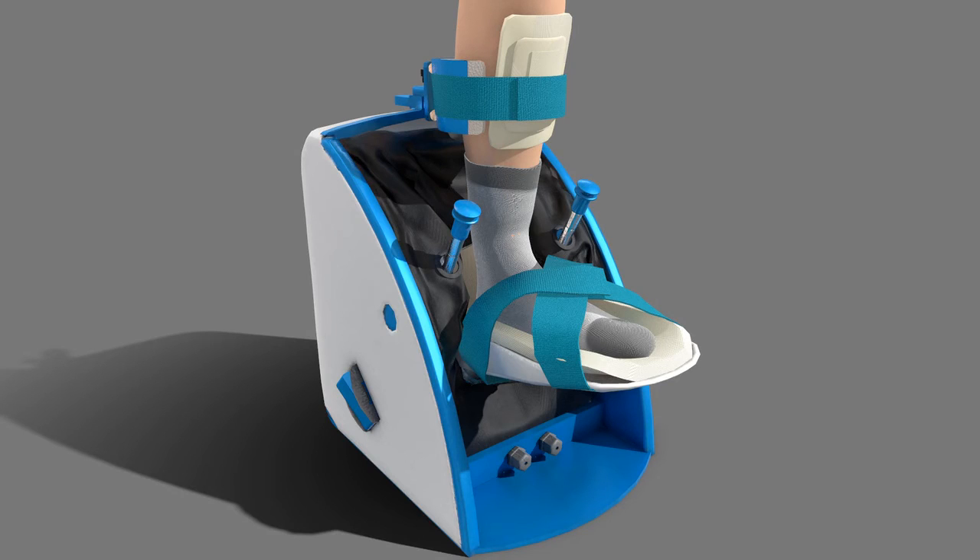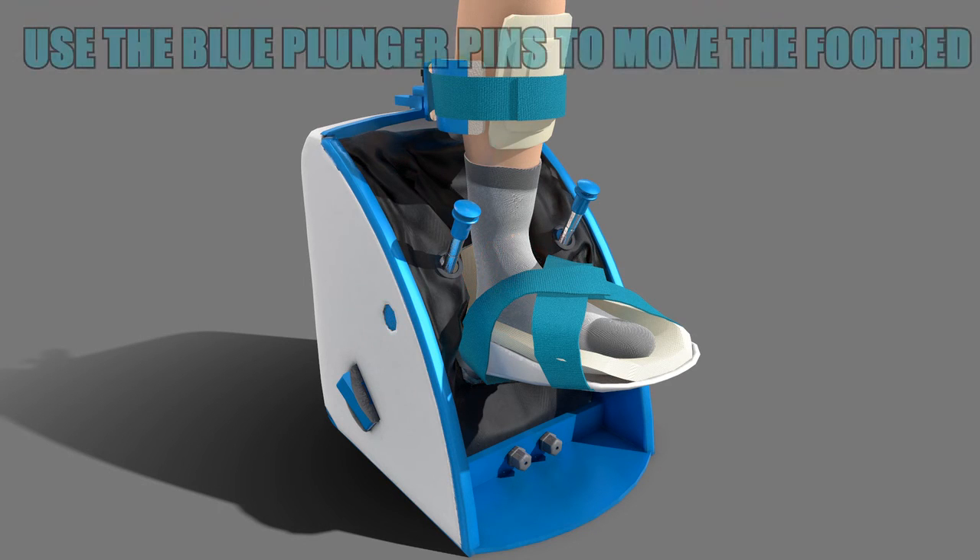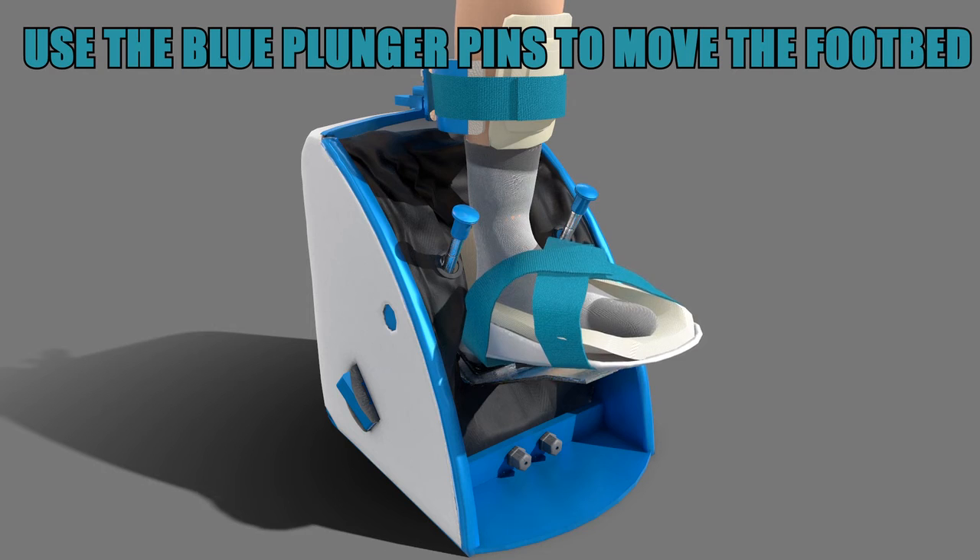Make sure that the ankle of the foot is in line with the blue circles on the foot mentor. You can also use the blue plunger pins to disengage the footbed. You can use this to adjust the foot mentor to be appropriate for the size of your feet.